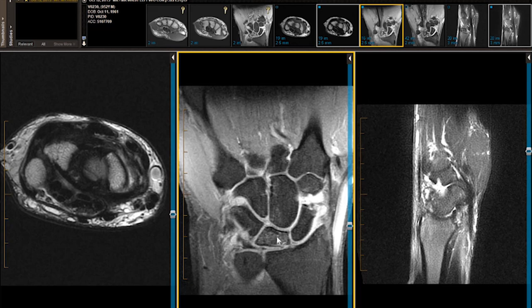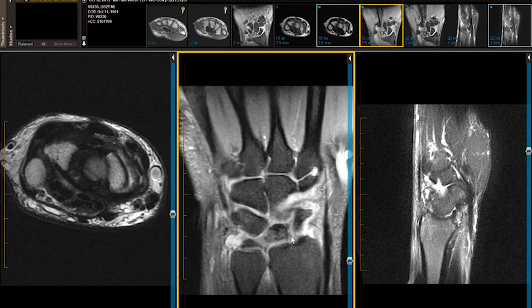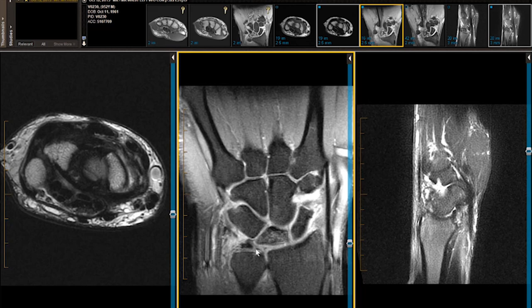I look at the scapholunate ligament and the lunatotriquitral ligament, and just as important — perhaps more important — I look at the intervals to see if they are arthritic, diastatic, inflamed, hyperintense, and/or eroded. And really, they're not. Perhaps there's a little irregularity at the scapholunate interval, but not much else. I observe the triangular fibrocartilage for its overall volume or height. It has some complex signal alteration in its central and inner third, consistent with a complex triangular fibrocartilage tear. So they were right.